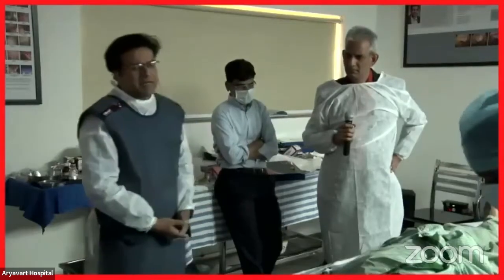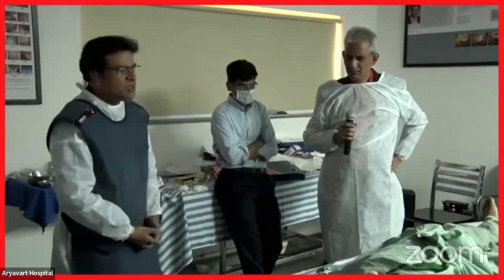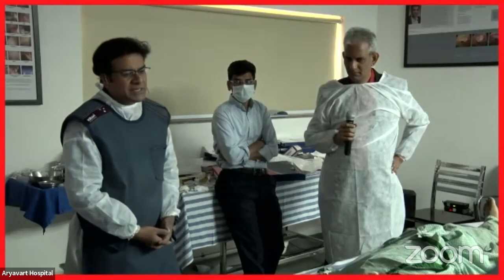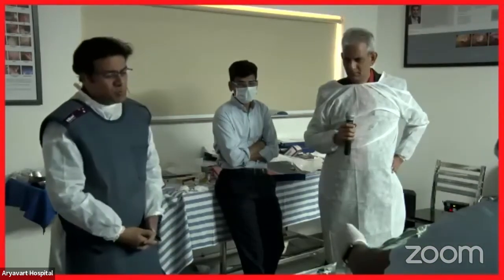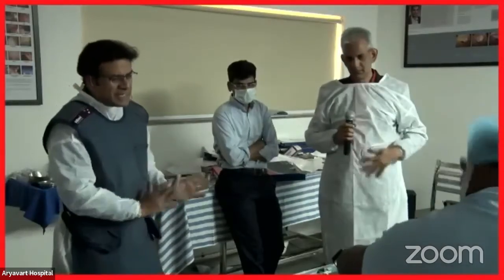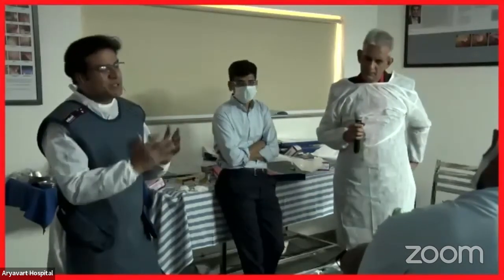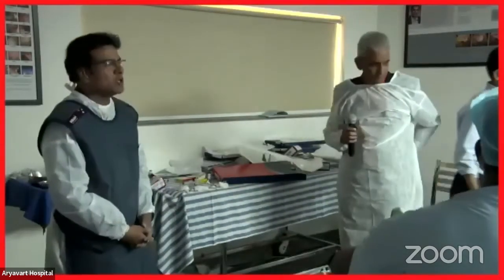Again, there are 2 more points. One is the size: the small bowel is usually less than 2.5 centimeters, while the colon is usually more than 3 centimeters. Second is the presence of valvulae conniventes and haustra: haustra are incomplete in the colon, and valvulae conniventes are complete in the small bowel. Identifying this needs a bit of experience, but these points in unison are what you should take up to make a diagnosis that you are in the small bowel and not in the colon.